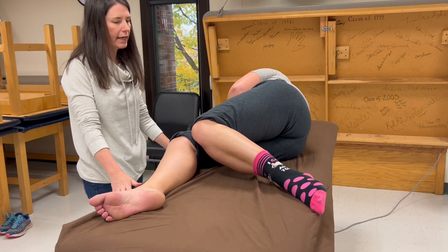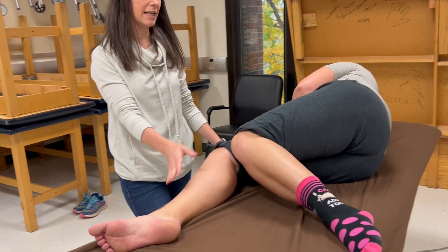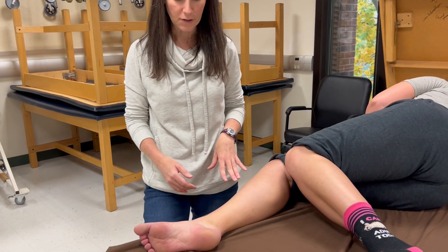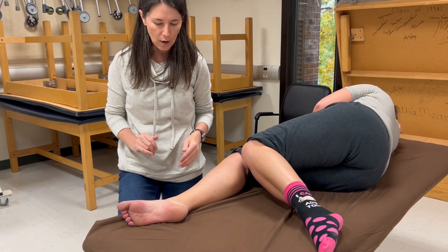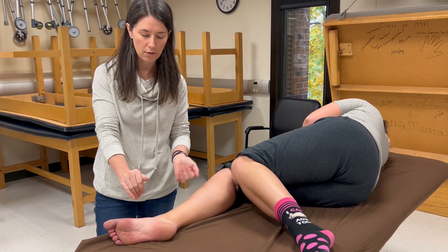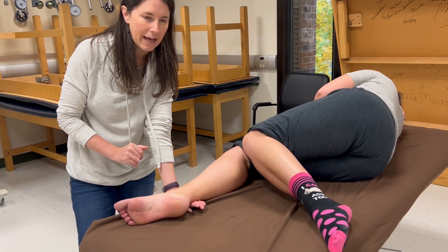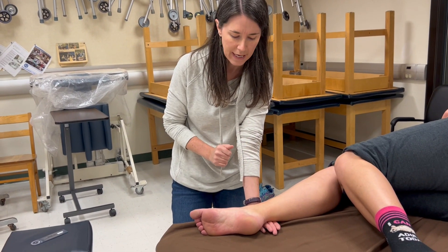When she's lying on her right side, we're testing the right leg. When she inverts, that's going to be against gravity, which we use for our grade three. I'm going to try to push the foot back down where it came from, so stabilization goes in the opposite direction — under the lateral aspect of the fibula at the distal end, just proximal to the ankle joint.